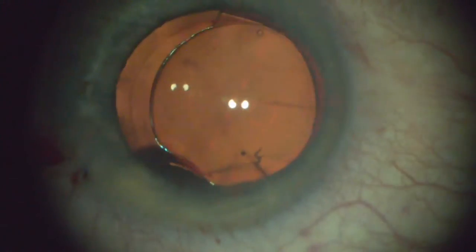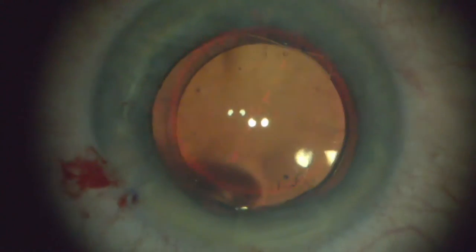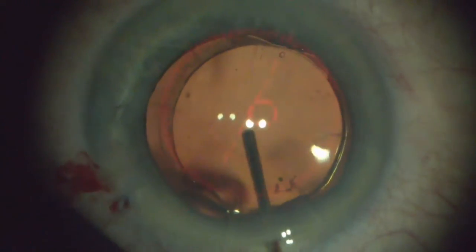I'm filling it back up with viscoelastic. As you see, there are four Purkinje images that you're seeing from the microscope. I'm measuring the pressure because I'm getting ready to use Aura. Two of those are from the lens itself, and two of those, of course, are from the microscope.